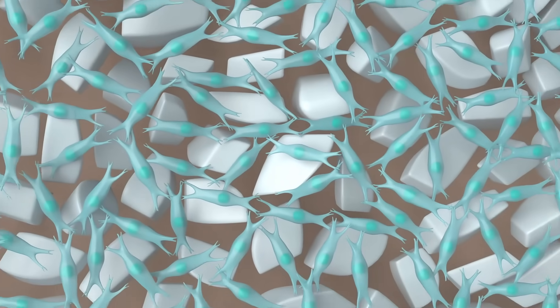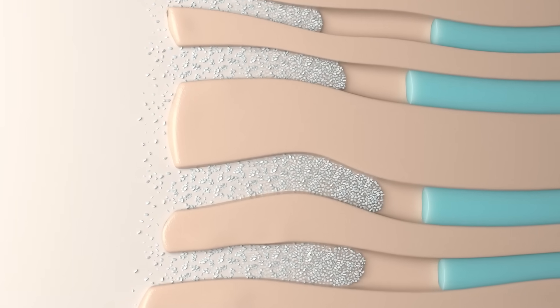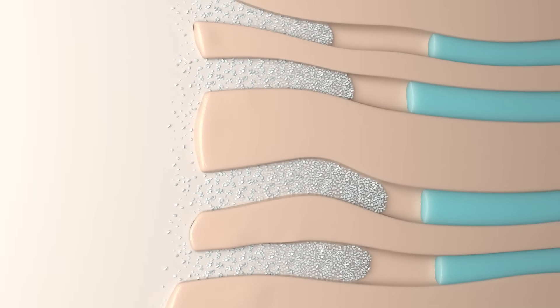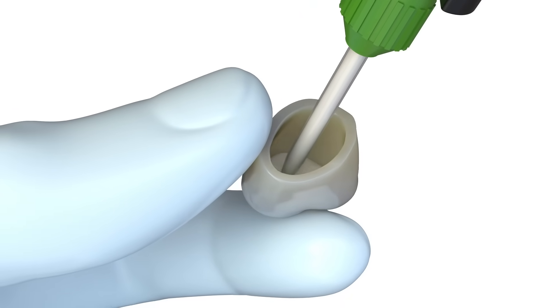SemPower's superior bond strength is due to its proprietary monomer's interaction and absorption into the tooth structure's hydroxyapatite. Here we can see SemPower being expressed into the crown preparation.